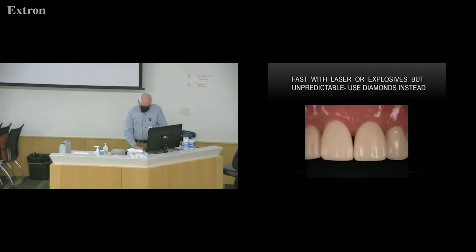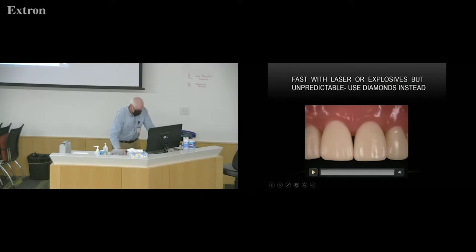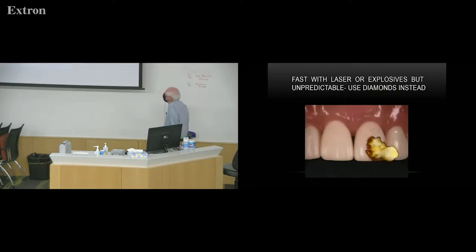Okay, so this is tongue in cheek. Bear with me. So using a laser or explosives is fast, but a little unpredictable. So we're going to use diamonds to do this, not burrs, diamonds. So far, have any of you used a diamond? No, you're going to today. So we're going to introduce you to diamond instruments.